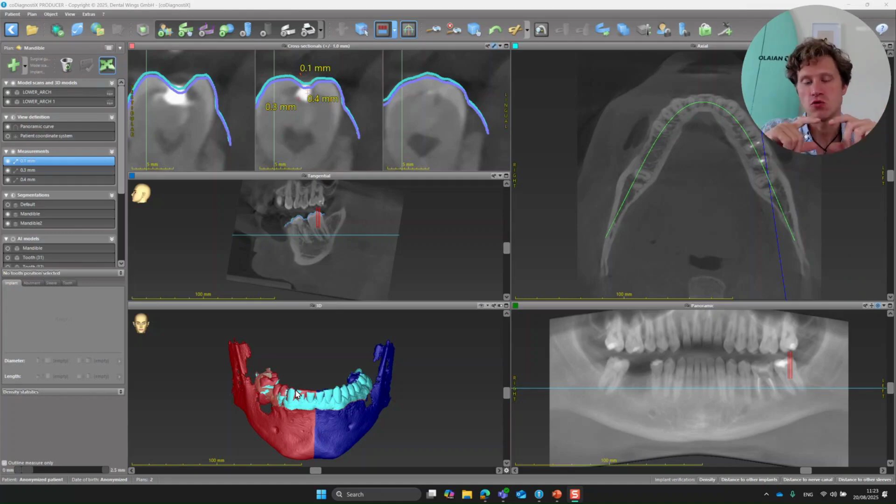So in this case, if you just treat your mandible, yes, you can reduce the slices and not scan both jaws, the maxilla and mandible. Just capture the mandible, but do not reduce the size of it, because the whole arch should be inside of the target, because otherwise you will have this issue. You also have an issue because of voxel size, because of the alignment, and you have a lot of issues, and you increase them more and more.